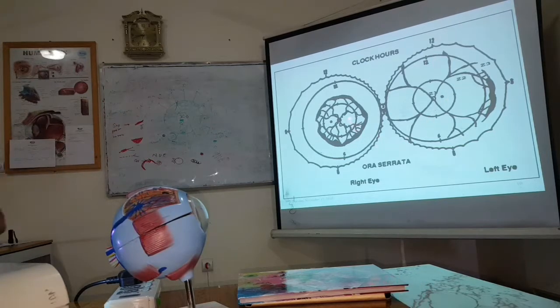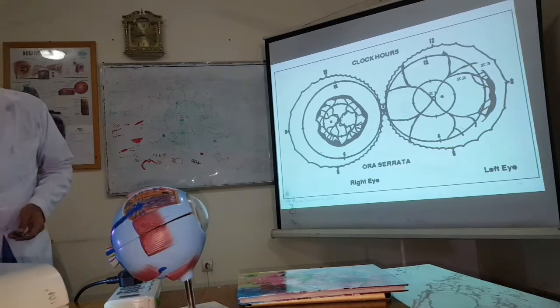In the next pictures you will see the optic nerve head is going to be located two discs nasally, but the fovea is in the center. So by looking at the location of the optic nerve head, you can also understand which eye this is. Okay, we'll go forward.